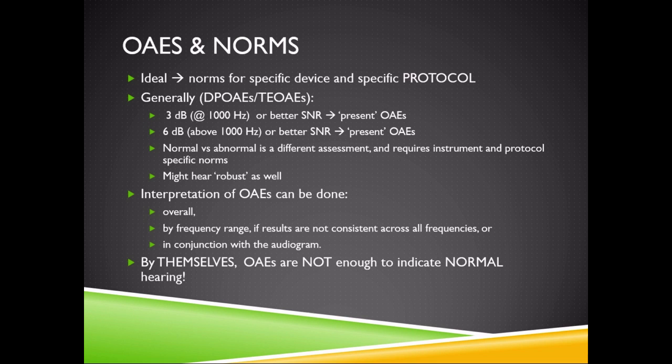OAEs by themselves are not synonymous with normal hearing. So you can't just test OAEs and say somebody has normal hearing. It's not enough.